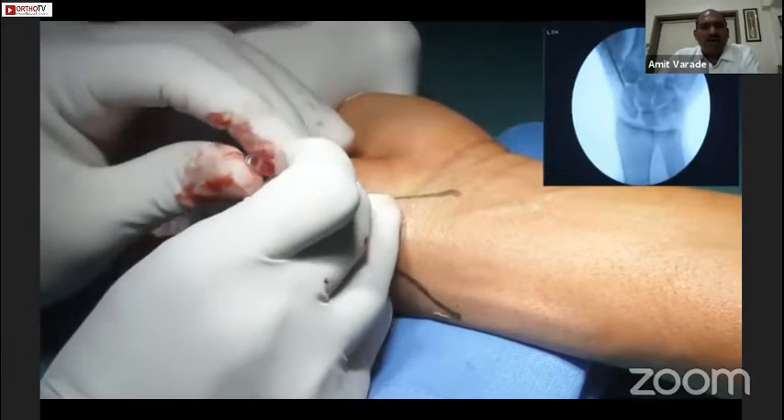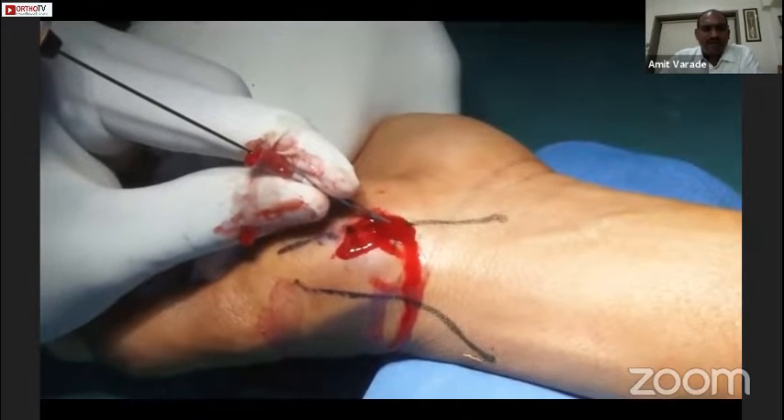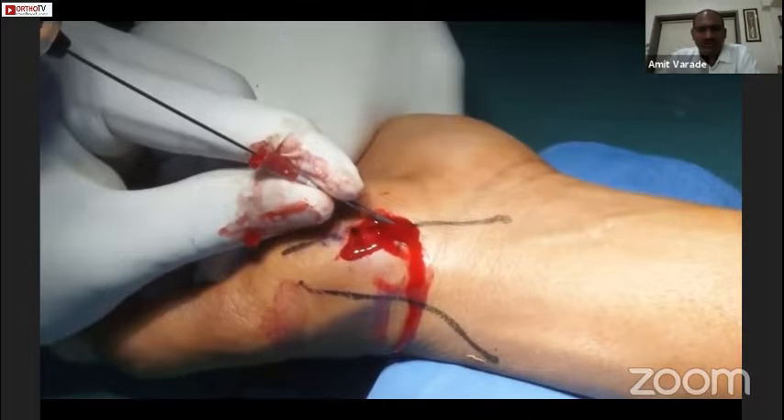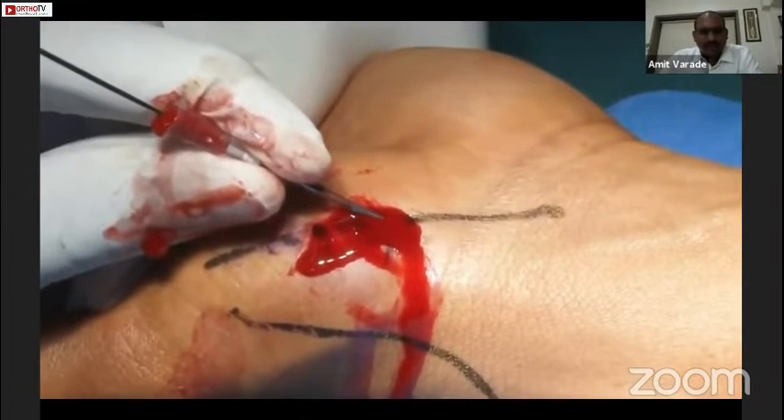We have to direct it along the long axis of the scaphoid, and at the same time we have to elevate our hand a bit, because the scaphoid is like a twisted cashew and it lies in three planes.